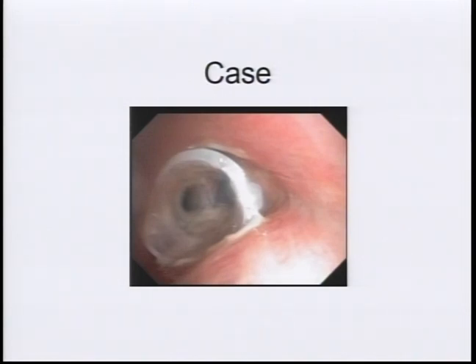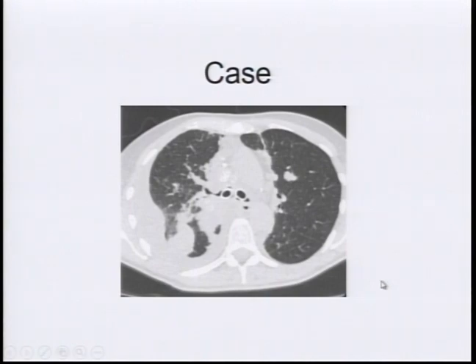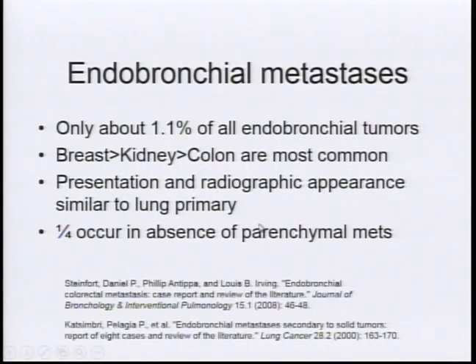Most of the stents we put in are removable. So you could potentially take them out once they're no longer needed, especially if someone has a transient need for it, if the obstruction is something that you expect might resolve with treatment with either chemotherapy or radiation. And this is the post X-ray where you see the stent in place.